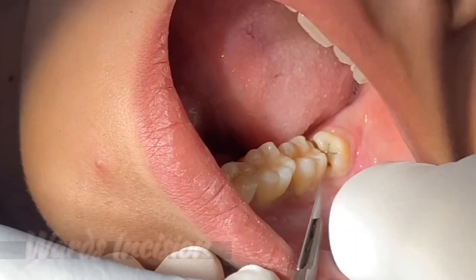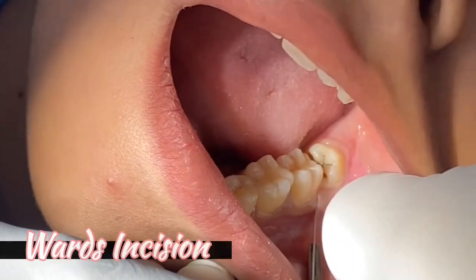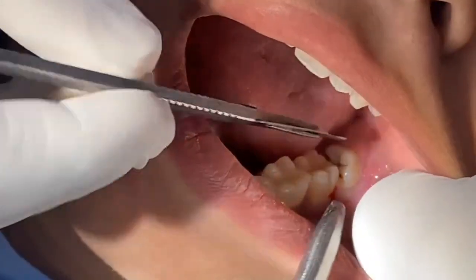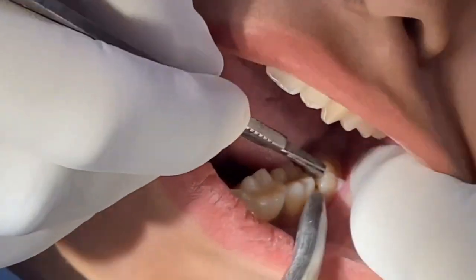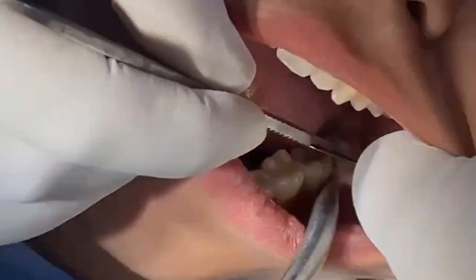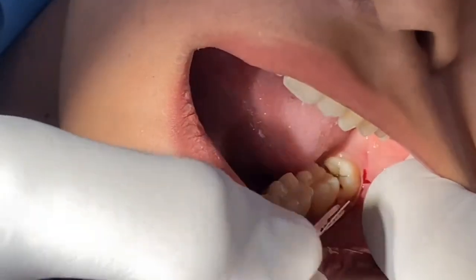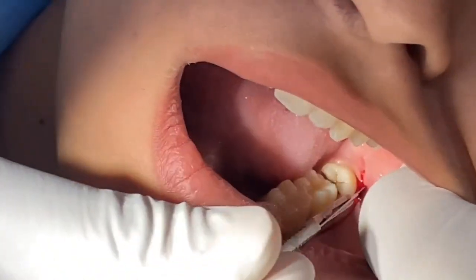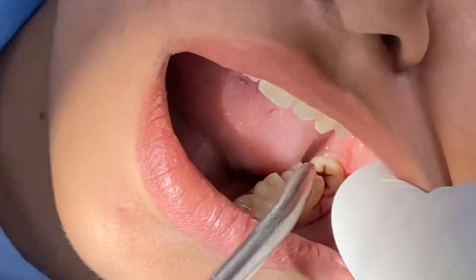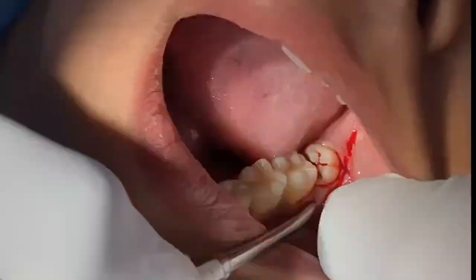This is the interdental papilla. We are using that interdental papilla and we give a small releasing incision here. One releasing incision here, one releasing incision will give. We are going to connect that with some amount of sulcular traction. See that is the releasing area we have done.